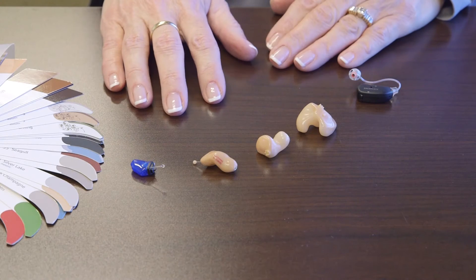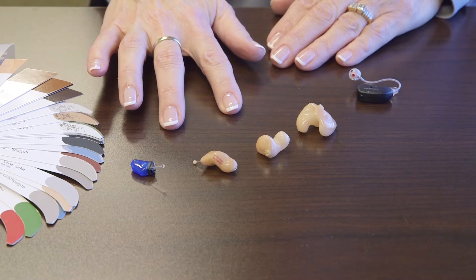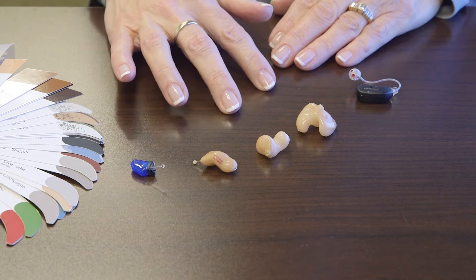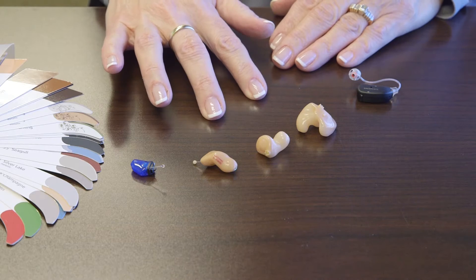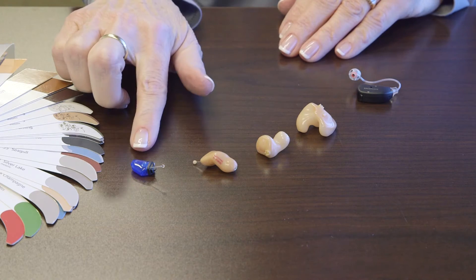Hearing aids come in many different styles. The one thing all of these hearing aids share is the same digital chip that dictates how they operate and how they work. But they just come in different houses, from behind the ear to deep in the ear canal.